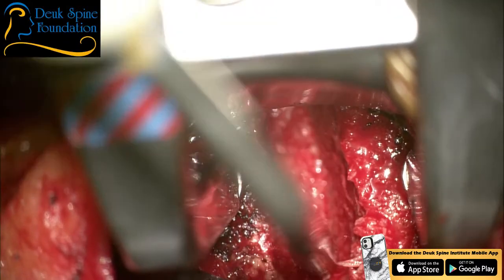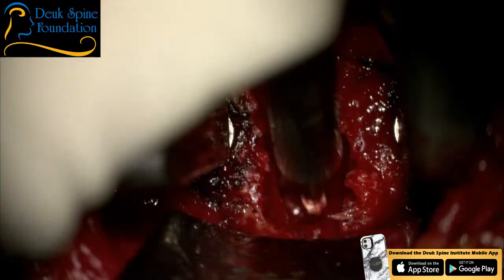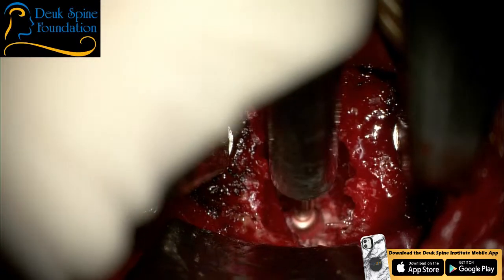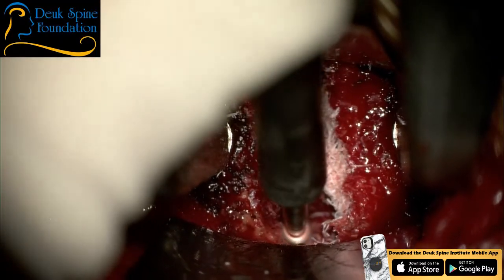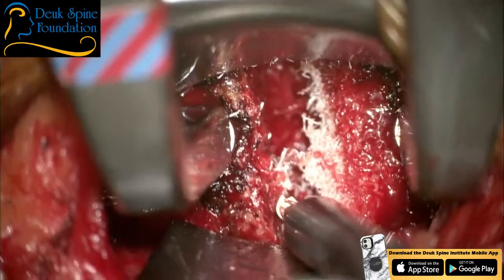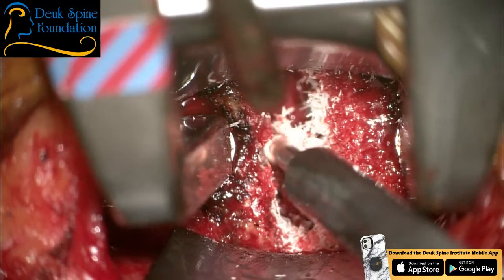Drill. So I could sit there and try to get it with a Kerrison, but every time I do that, I'm potentially going to traumatize the nerve root because the foot plate of the Kerrison goes against the nerve. So I'm actually just going to drill some of this bone away a little bit more laterally and open things up. A little bit of spur here at the bottom. Remember, we're going to put a spacer in here, so I want to get rid of all the lip spur so it's nice and parallel.